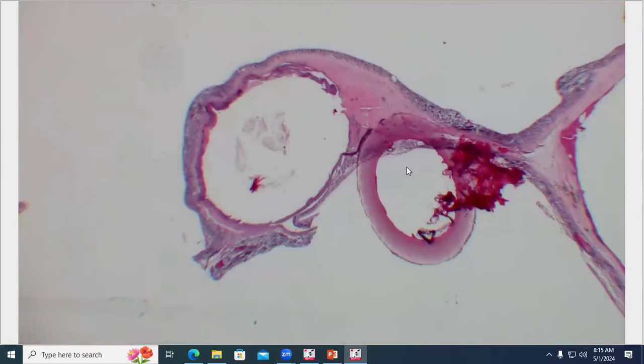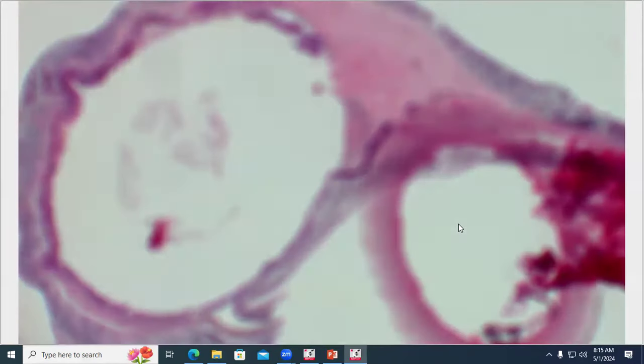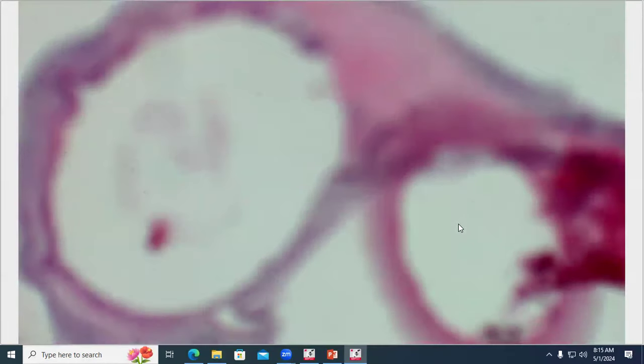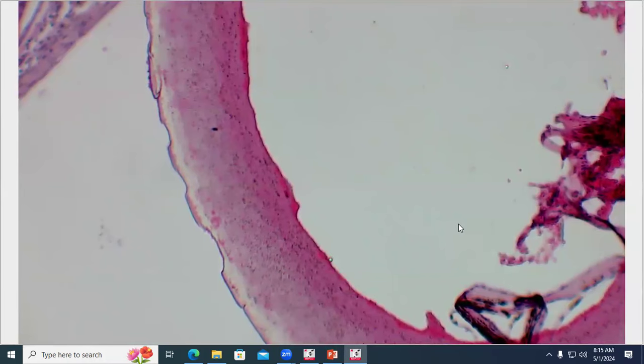All right, so here it is in a section. It's this oval-shaped thing. The contents in the core have sort of shelled out funny, but this surrounding is still visible. And it kind of is reminiscent of a hair shaft, right? We have this somewhat melanized pink outer cuticle of sorts. And the fun party trick is always to polarize it.